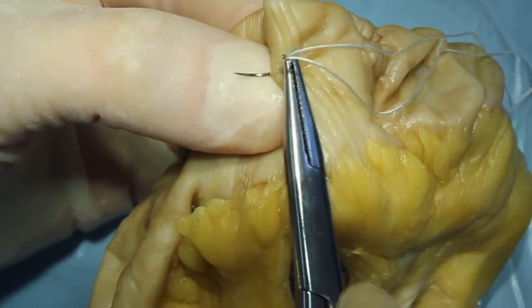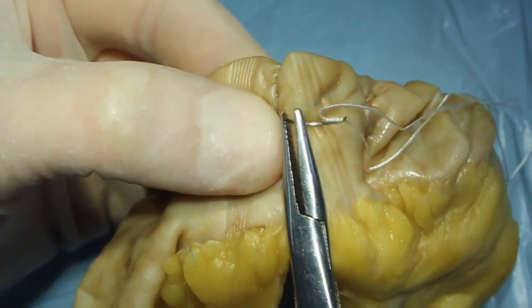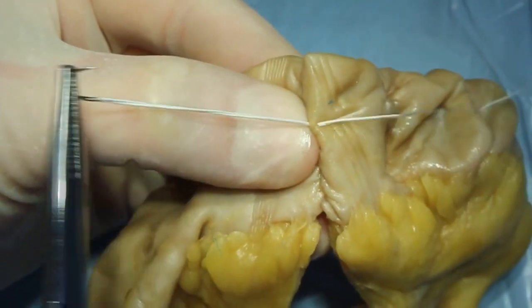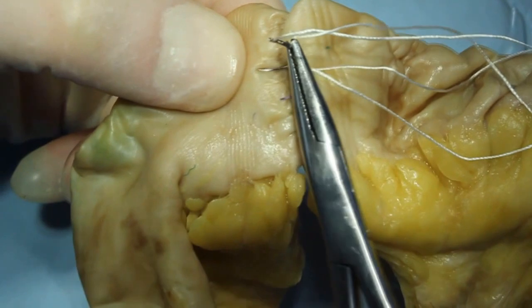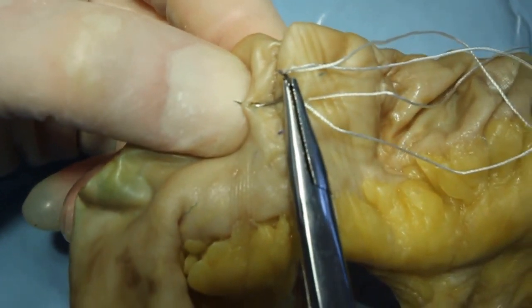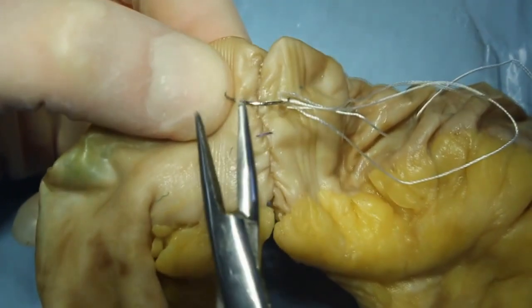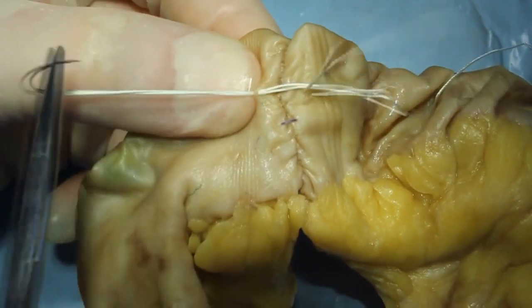The loop of the intestine is fixed in the left hand in such a way — the thumb is on the anterior surface of the loop, the rest of the fingers on the posterior one. The input and output of the needle is done in cross-direction to a dirty uninterrupted suture, 7 or 8 mm aside from its edges.